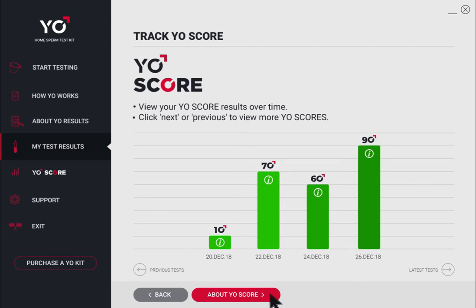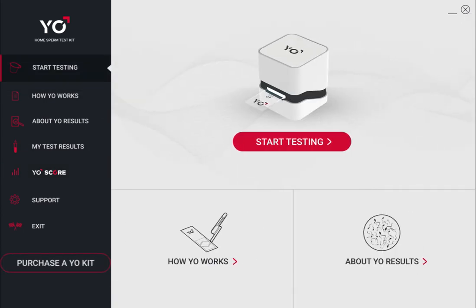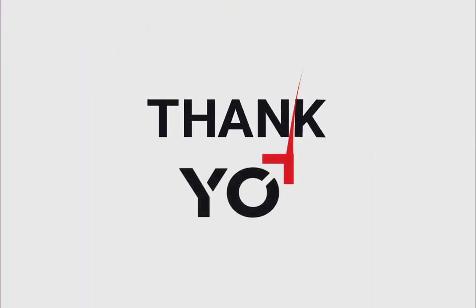Click About Yo Score for personalized information about your Yo score results and suggestions for how you might improve your score. Click Exit to leave Yo, or purchase a Yo kit to easily order a refill kit for additional testing. Thank Yo for watching this Yo demo.